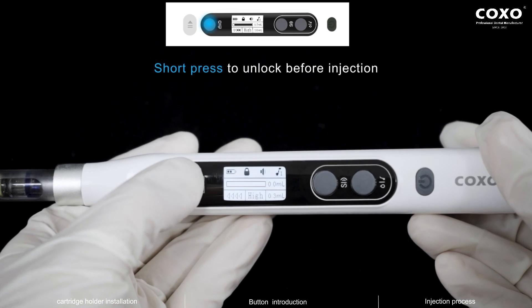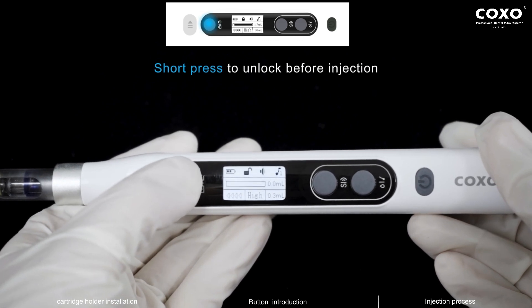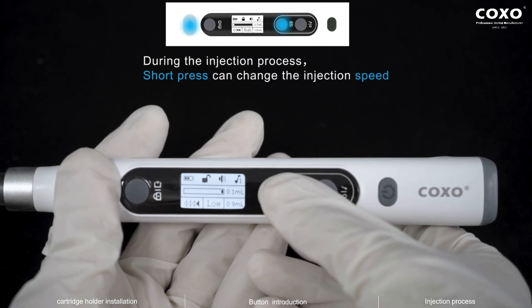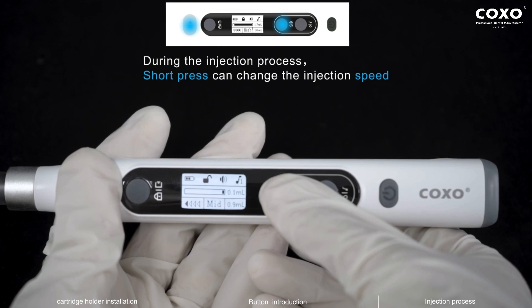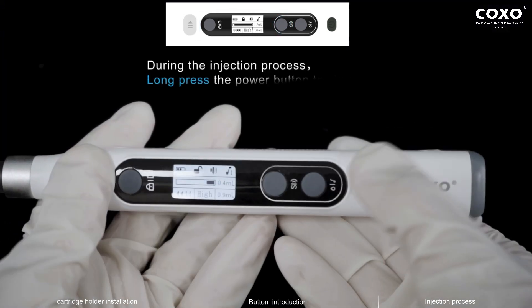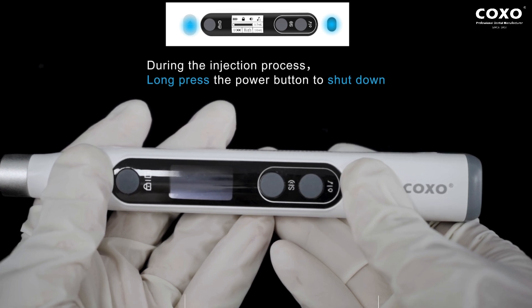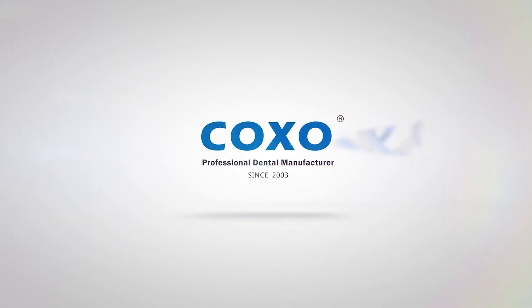Injection process. Short press to unlock before injection. During the injection process, long press can change the injection volume. During the injection process, short press can change the injection speed. During the injection process, long press the power button to shut down and stop pushing.